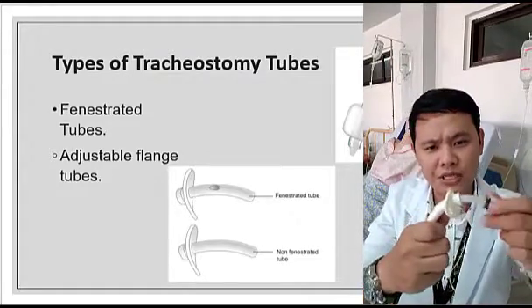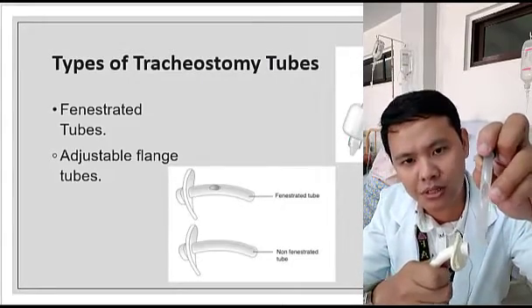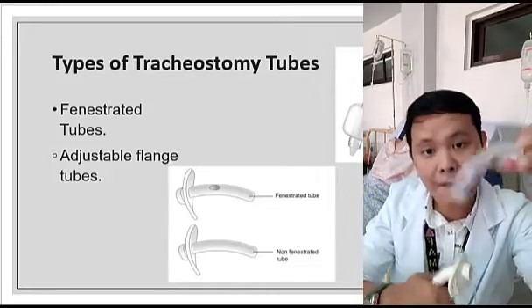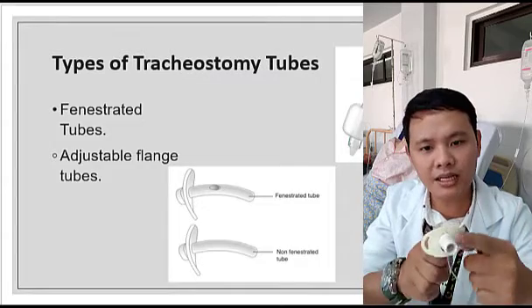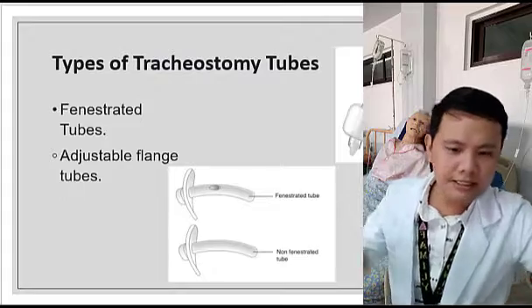Okay, papalitan po natin yung inner tube. Okay, kita ninyo the hole or the fenestration. Papalitan na natin to with this one, yung wala. Okay, nasa ganun. Pag pinasok po natin ito, close tayo sa may tube na to, ang hinga ng pasyente ay nandito. Okay? So what else?